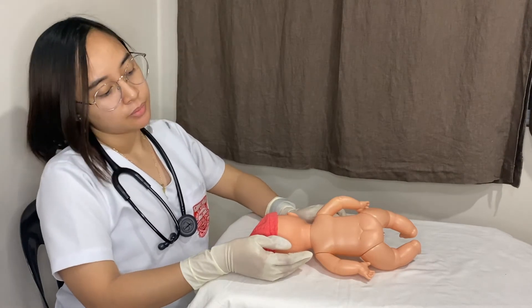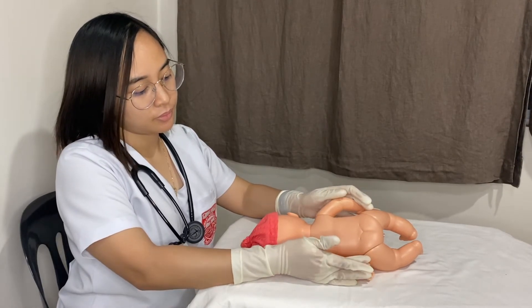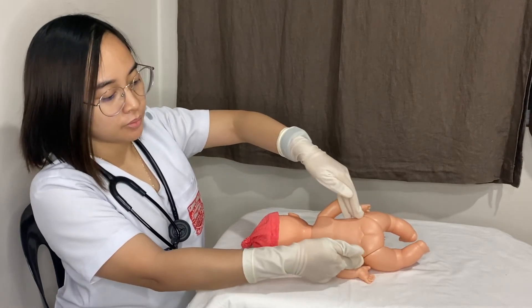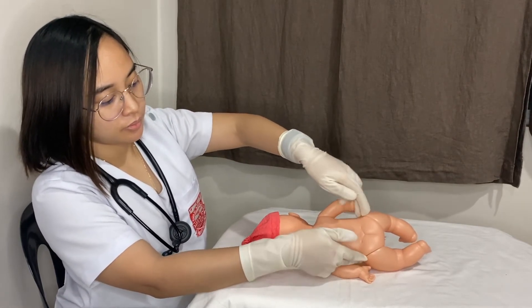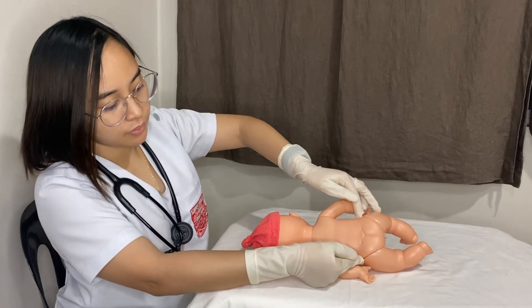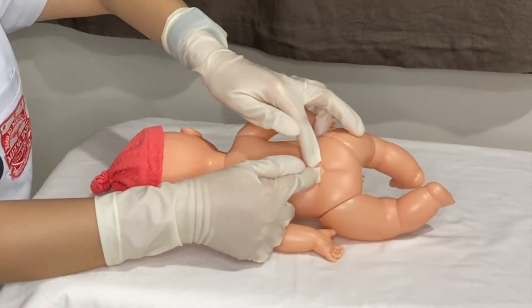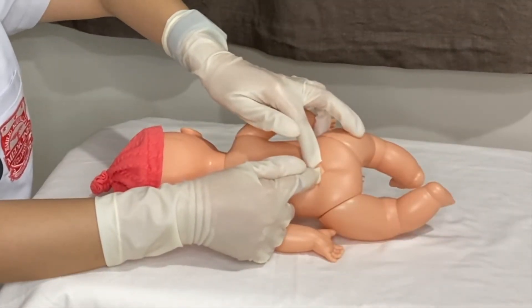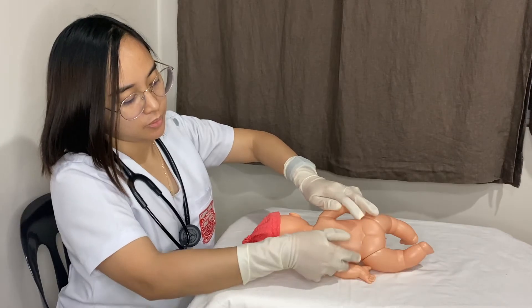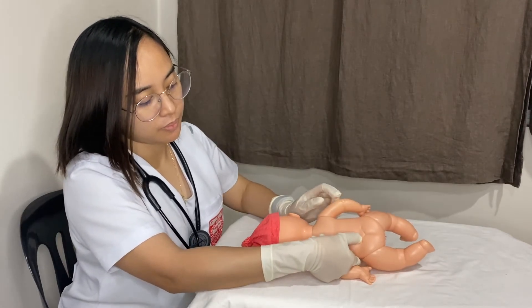Landmarking is important both for the application of the anesthetic and for performing the procedure itself. Identify the iliac crest on each side of the infant. Place one finger on each crest and trace your fingers together across an imaginary line. This will lead you to the site of the puncture in the midline at about the L3 or L4 level, which is below the end of the spinal cord.